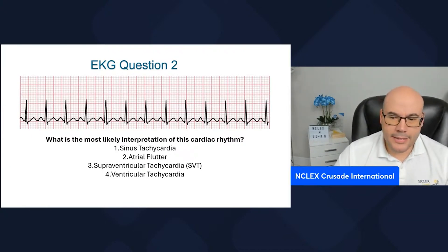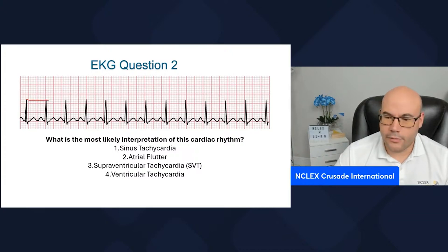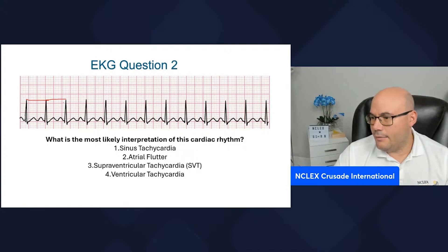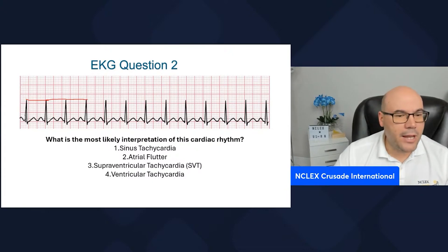Number one, let's identify if this is a regular rhythm. We can see we have two big squares and a small square on the first R2R interval. From the second R2R interval to the third, we have two big squares and a little bit more than one. From the third to the fourth, we have two big squares and about one and a half small boxes — about the same. So this is a regular rhythm.